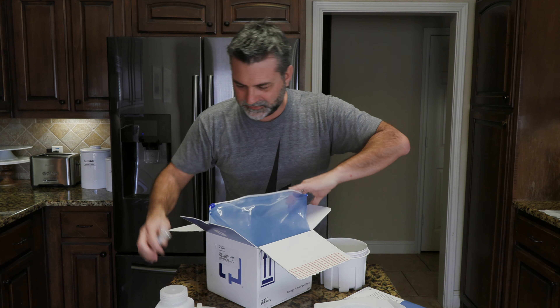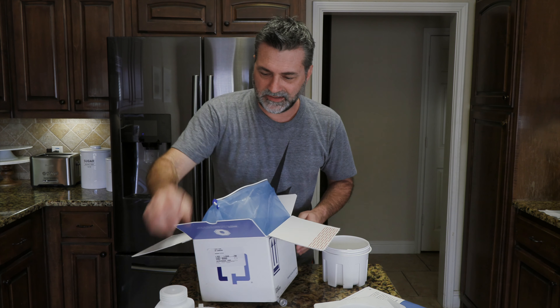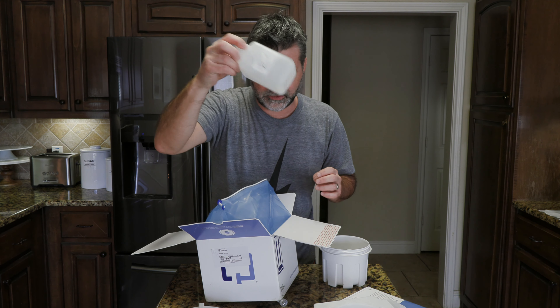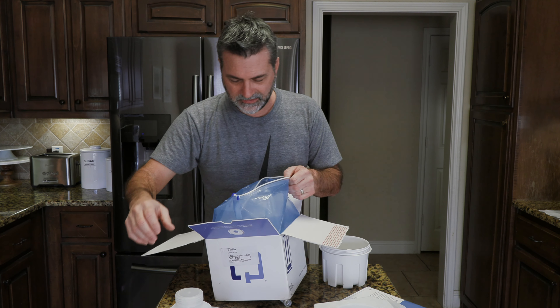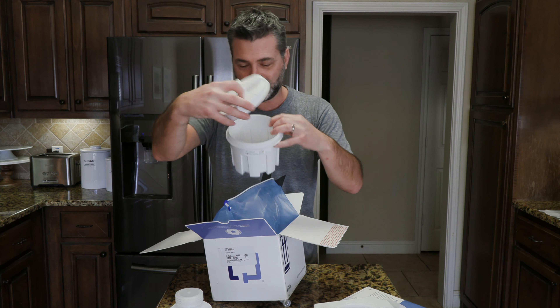Put it back in the box. This is what the box looks like on the inside — it has a place to put everything back where it goes. I guess you throw the liquid container away, because once you pour it in there, you just chunk that. Do not drink it — they say do not drink it. I don't know who would want to drink this, but there's a warning. After you've done everything you need to do, close it all back up, put it in here, and then take it to UPS.